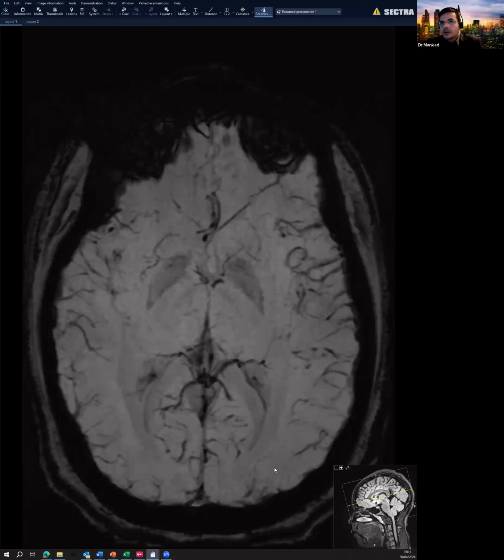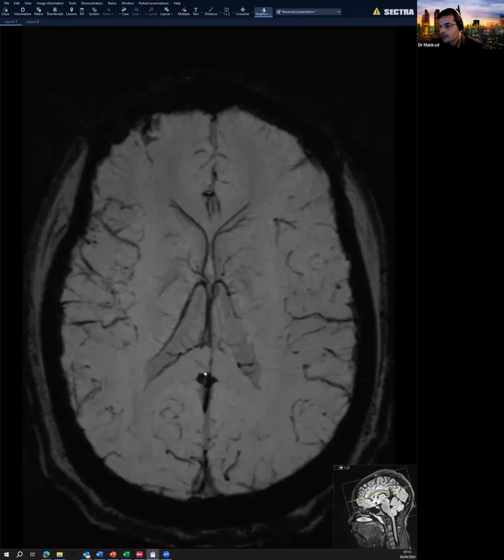So why is it useful? Now, it's a very pure magnetic field that the scanner gives you, very strong and very pure. Excellent. Any impurity in that field throws in a big artifact, whether it is a nail passing across or a fleck of calcification, whether it is paramagnetic or diamagnetic substances. So this is very, very sensitive to picking up hemorrhage and blood products, particularly heme degradation products. It is also sensitive in terms of picking up calcification.